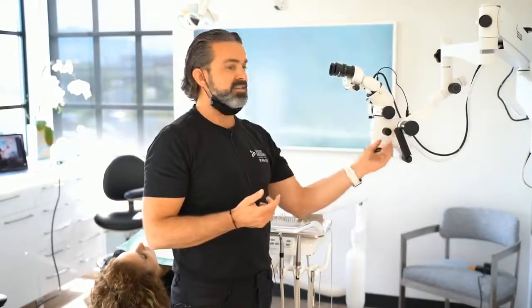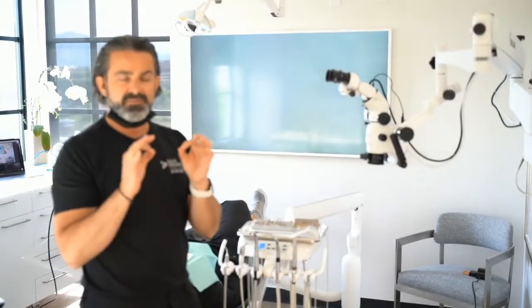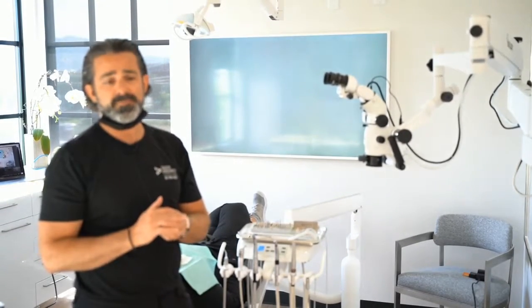The 6 is only if I'm looking at a crack and I have something very, very specific, very, very detailed. And when you're up at a 6, then I'm also cranking the light power all the way up.